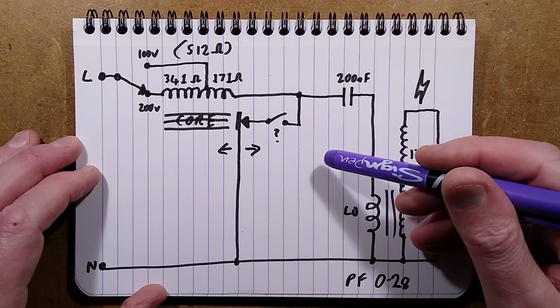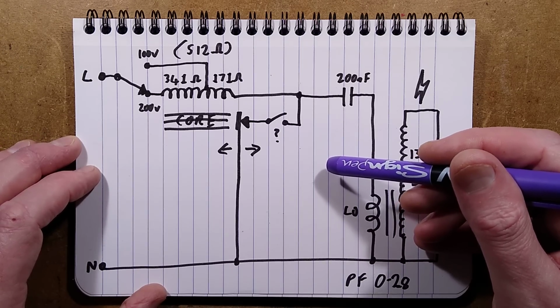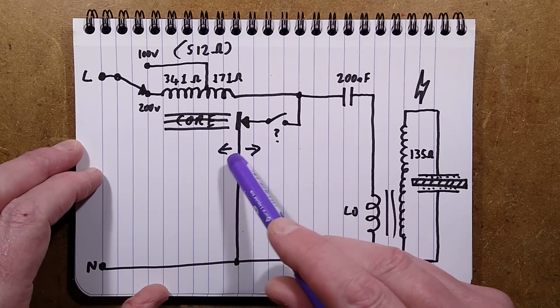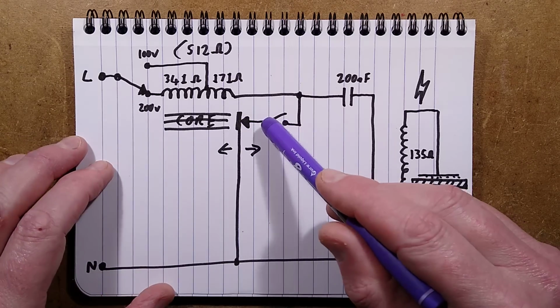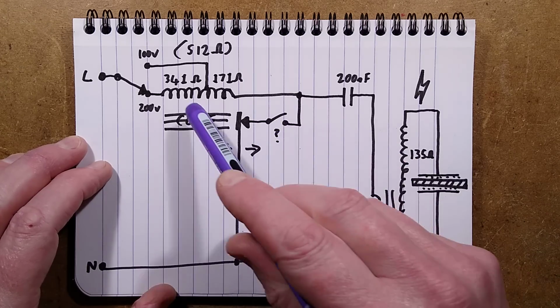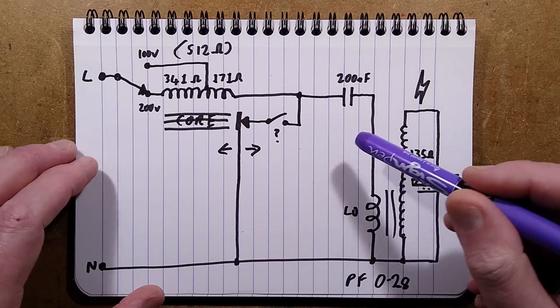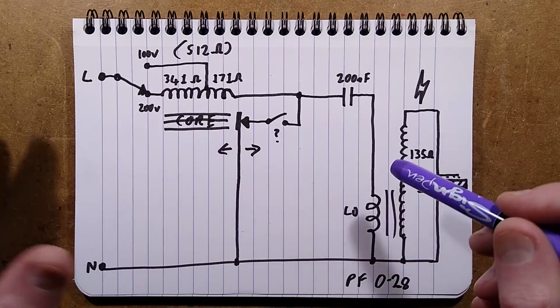I'd be more worried about all the radio hams shaking their fists in the air and shouting about the electrical noise I just generated. So this is a vibrating contact down here, and this moves backwards and forwards as indicated by these arrows against that adjustable contact. The switch is in series with that contact, which is very strange because it means you turn it off, it still can pass AC current through the capacitor and the high voltage transformer. A bit strange that. I thought they would have put the switch maybe here or there, but they didn't.